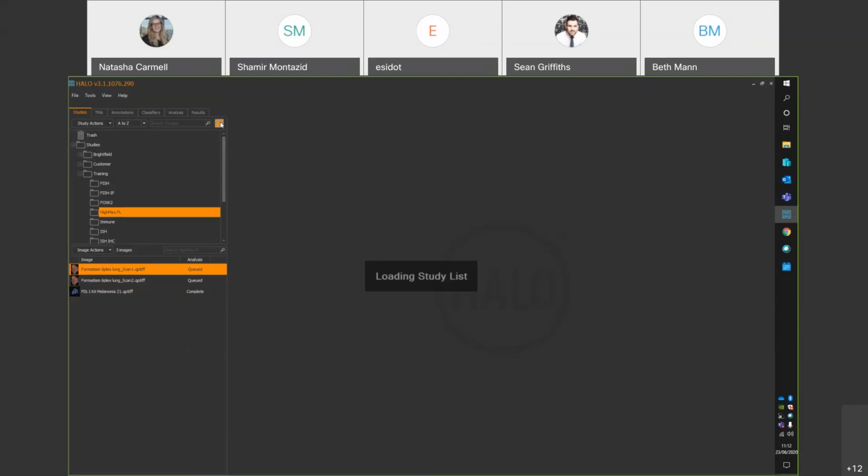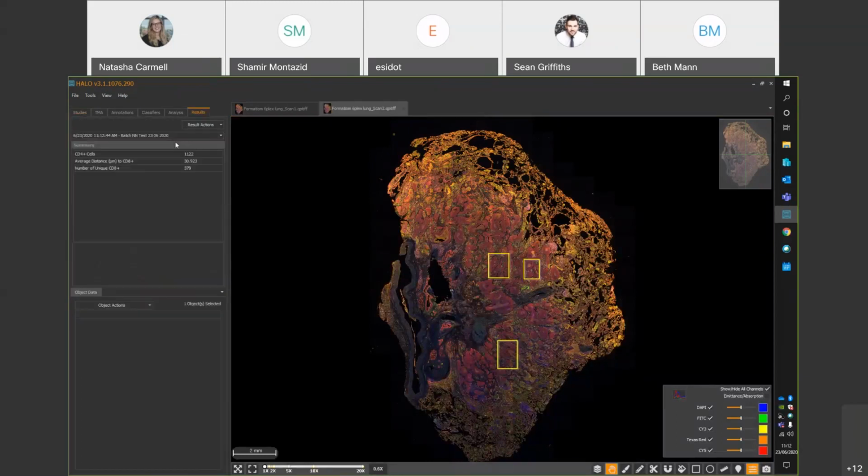So one thing to note with batch spatial analysis is that obviously we've set our filters based on phenotypes. So it's very important for your phenotypes to have identical names. That even comes down to capital letters and spacing. So we'll see both of these images. When we open them, they've got identical phenotypes which have been specified. And that is key to being able to run batch spatial analysis successfully. Make sure you have your phenotypes labeled identically.